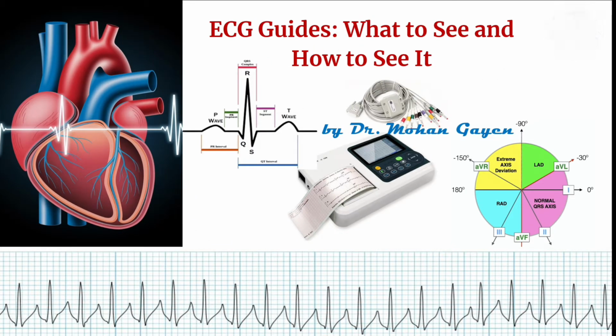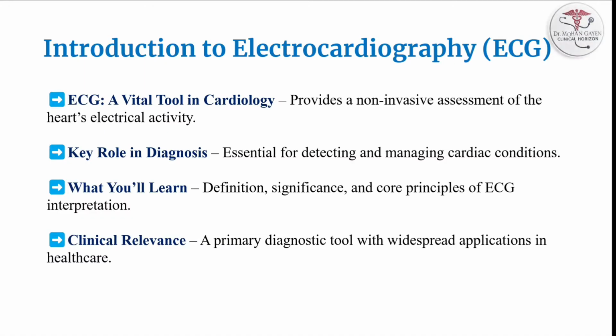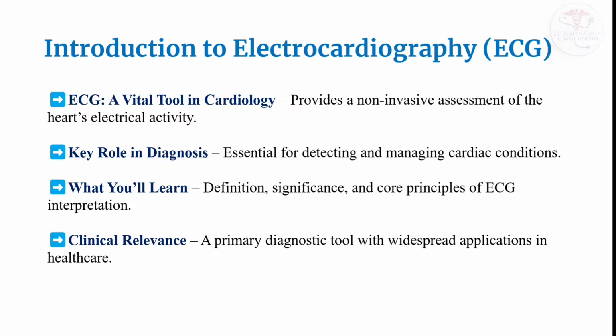Introduction to Electrocardiography, or ECG. The electrocardiogram, or ECG, is an essential tool in cardiology that allows us to visualize the electrical activity of the heart. It is a non-invasive, painless, and quick diagnostic method that plays a critical role in detecting and monitoring cardiac conditions. From identifying life-threatening arrhythmias to evaluating the effects of treatment, ECG interpretation is a fundamental skill in modern medicine.